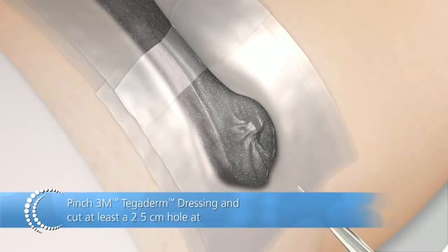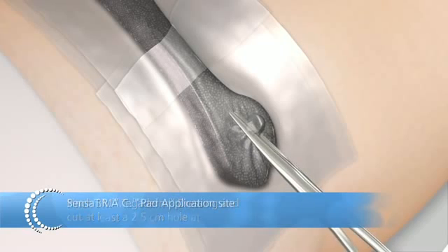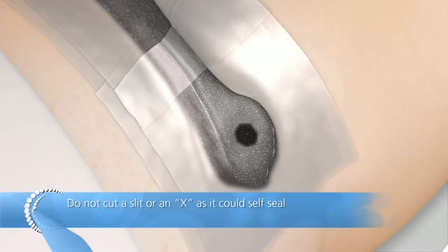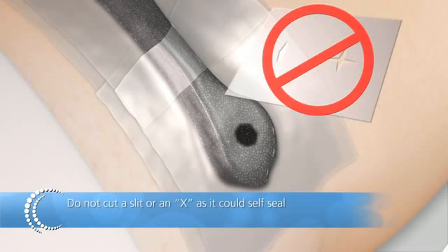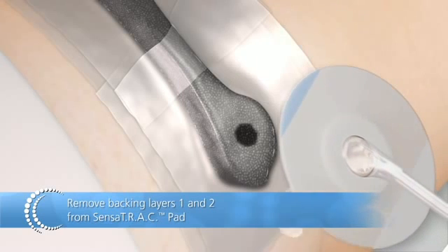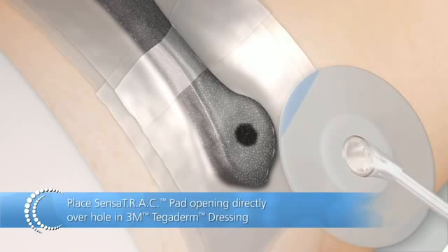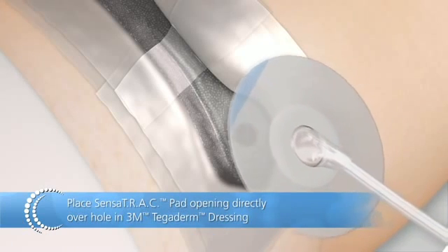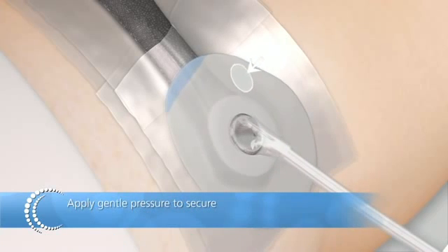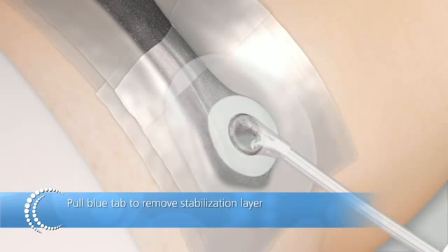Pinch 3M Tegaderm dressing and cut at least a 2.5 centimeter hole at SensaTrack pad application site. Do not cut a slit or an X as it could self-seal. Remove backing layers 1 and 2 from SensaTrack pad. Place SensaTrack pad opening directly over hole in 3M Tegaderm dressing. Apply gentle pressure to secure. Pull blue tab to remove stabilization layer.